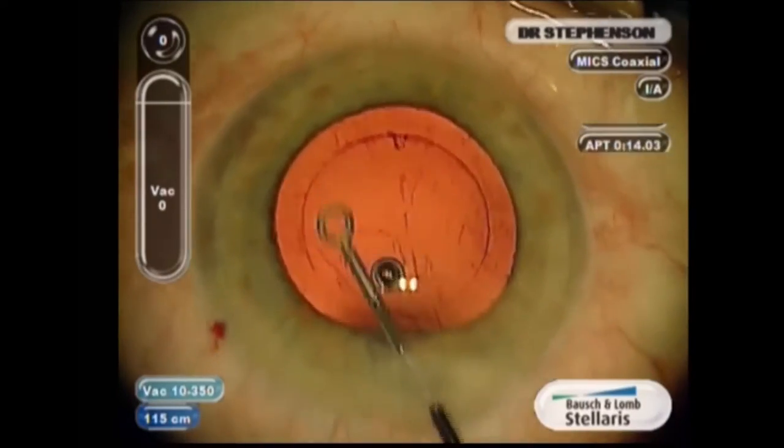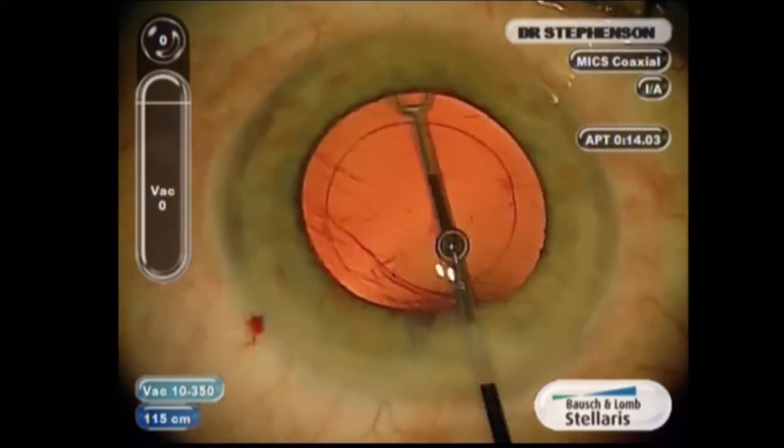Hi, I'm Dee Stevenson. I'd like to share some techniques on how to insert the Acreos lens. This is a mix lens. It goes through a very small incision, a 1.8 millimeter incision.